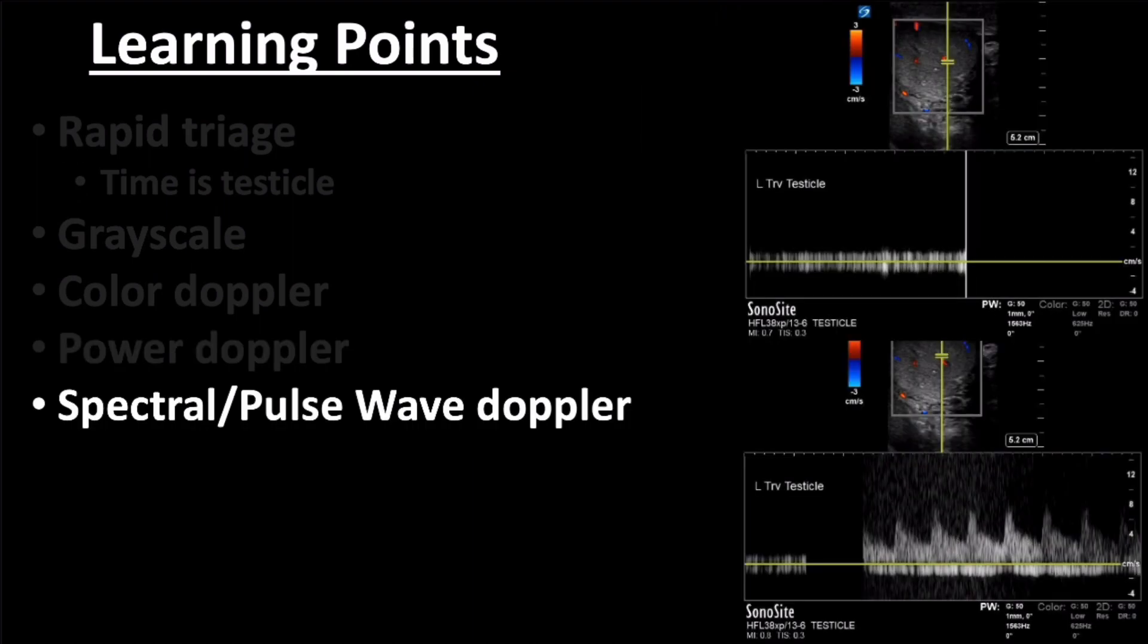While quite easy, utilization of spectral and pulse wave Doppler might be beyond the comfort level of many viewers, yet inclusion of this step is essential to perform a true torsion rule out study. This step will be performed in any radiology-performed study.